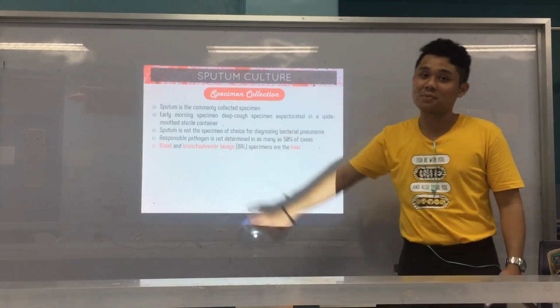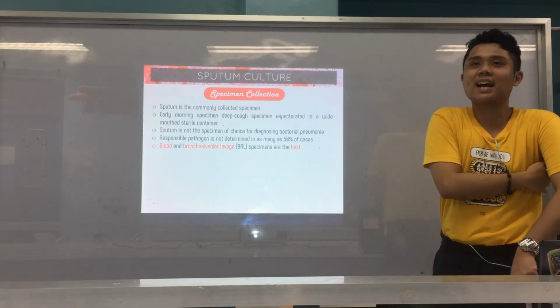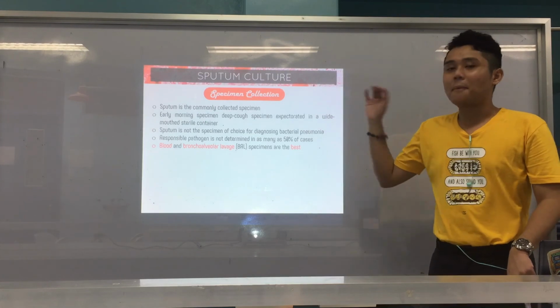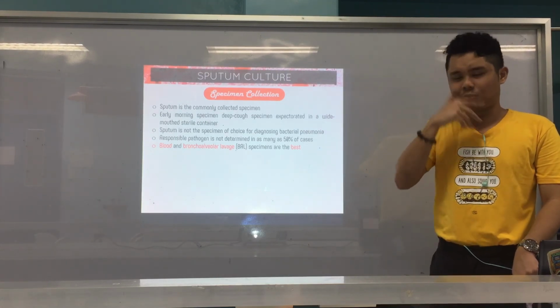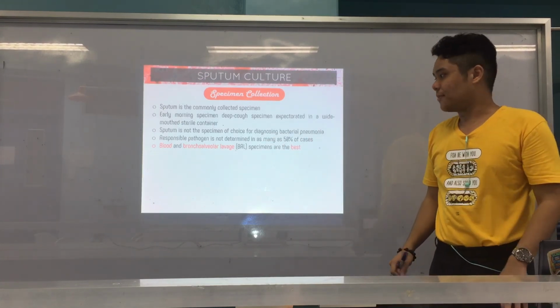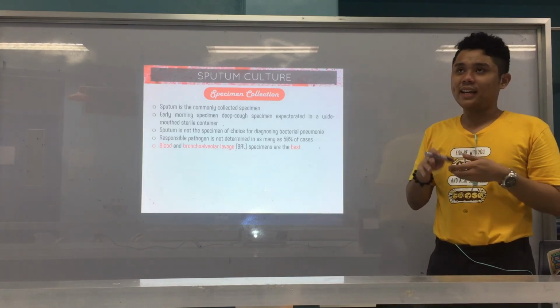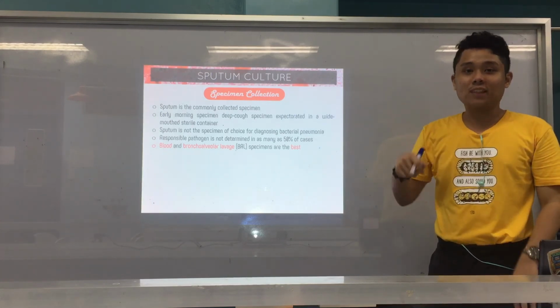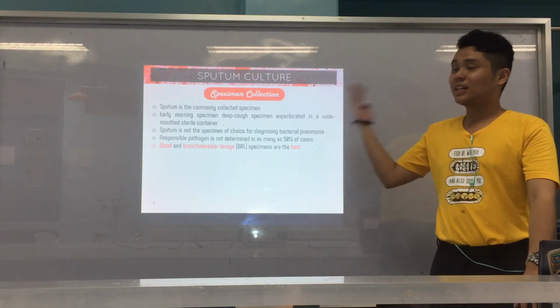This BAL came out in the boards. What does BAL mean? What type of specimen is BAL? A respiratory specimen. And what is the best specimen for the lower respiratory tract for bacteriology or microbiology? BAL. Please take note. Bronchoalveolar lavage. It is an invasive procedure, where an instrument is inserted down to the bronchioles and a sample is taken from there. So bronchoalveolar lavage is first. We'll discuss this later.